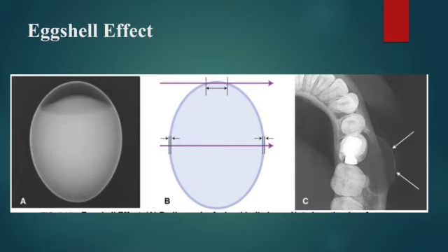The eggshell effect accounts for why normal structures such as the lamina dura, border of the maxillary sinus, and nasal fossa, and abnormal structures including the cortical wall of a cyst or benign tumor, are well demonstrated on the plain radiograph. Soft tissue masses such as the nose and tongue do not show the eggshell effect because they are uniform rather than being composed of a dense layer surrounded by a lucent interior.